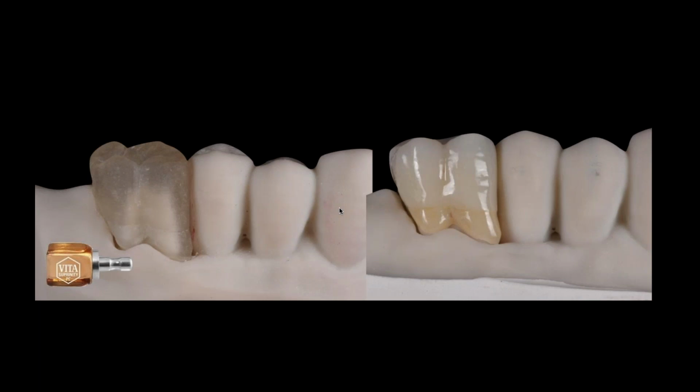I know a lot of people are angling up and changing the angulations, and I think it works well. We're kind of staying a little on the simpler side. I guess as a small laboratory, we can get away with 4 or 5 prints on our table rather than having to try to squeeze a million in there.